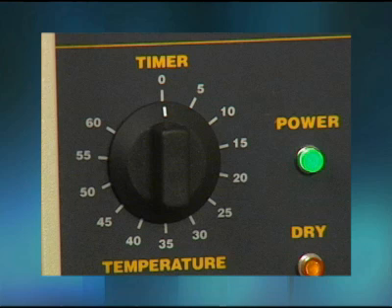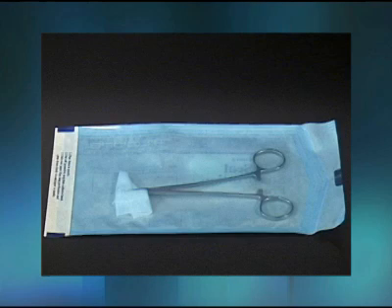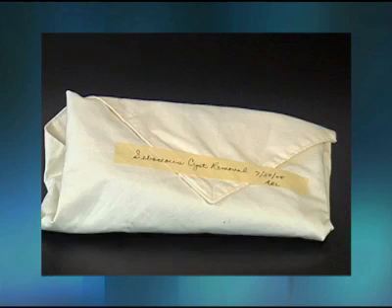The length of time required to sterilize an article varies according to the item that is being sterilized. A hard, non-porous item, such as a wrapped surgical instrument, requires approximately 20 minutes of sterilizing time. However, a large minor office surgery pack requires approximately 30 minutes because more time is needed for the steam to penetrate to the center of the pack.